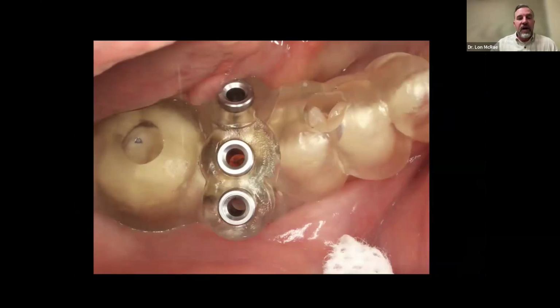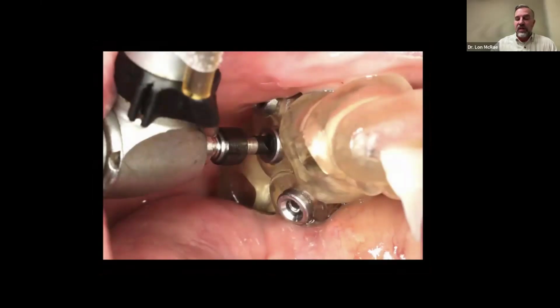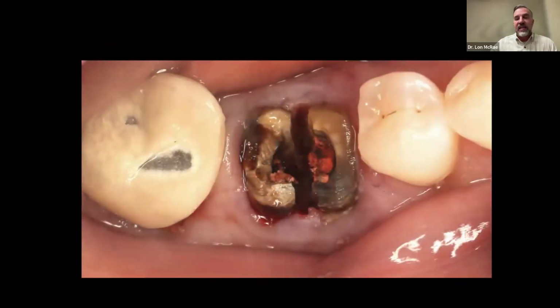Here is the furcation guide. This is very unique to All In. We discussed how we could make this easier for clinicians to go through exactly where they need to go through. So there are guide pins. We know the depth of those guide pins, and it's a 2 mm guide pin. We go in with those guide pins exactly where we need to go and at the depth that we need to go, and it gives me 3 holes. I then take my surgical drill and I just connect the dots at the exact depth. Fairly simple, and you can propriocept, you can feel exactly where you need to go from there.